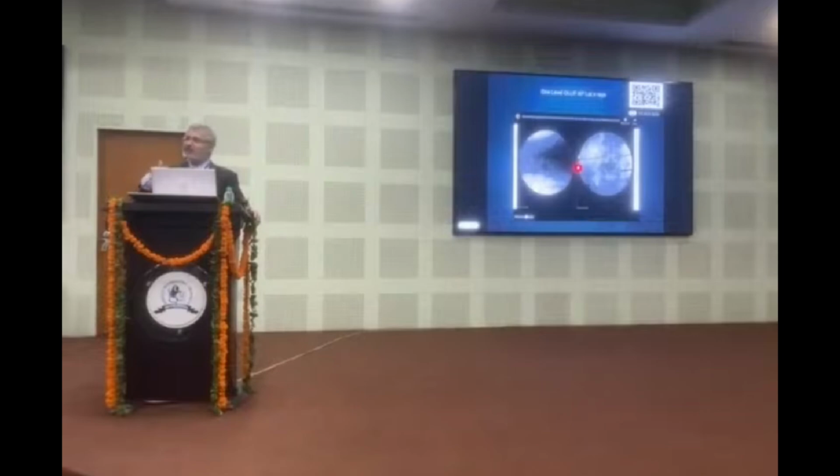When you open it up, the band and the nerves are not always easily recognizable. You stimulate them. You put electricity on that, to see if it's a nerve or just a band. Because if it's a nerve, you don't want to cut it. If it's a band, you cut it and you close, and everything is great. So, who wants to tell me what amount of current in milliamps you need when you do a tethered cord, where you go to a nerve that looks like a peripheral nerve, but you don't have dura around it? Just throw a number out. What milliamp amount of electricity do you use?